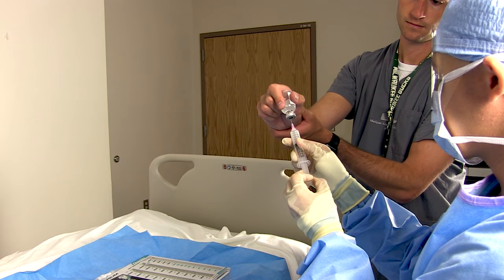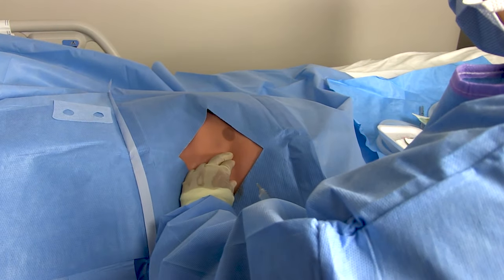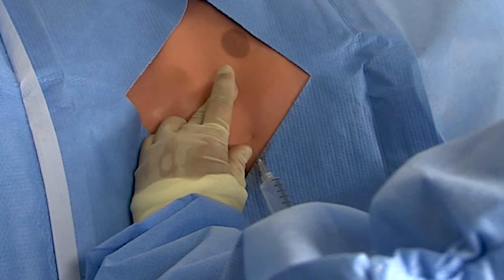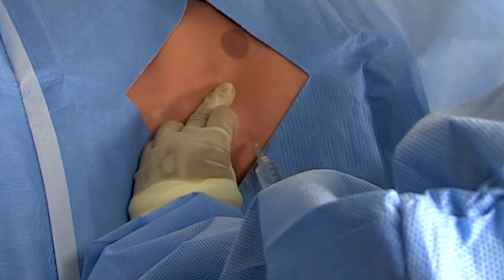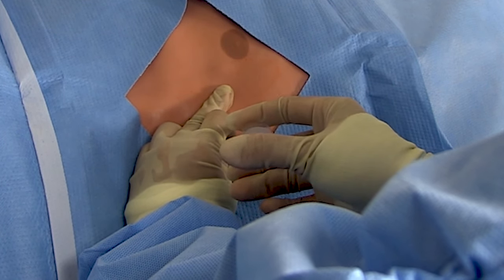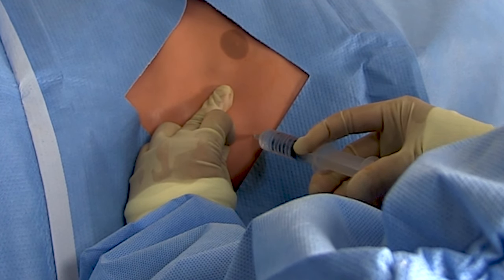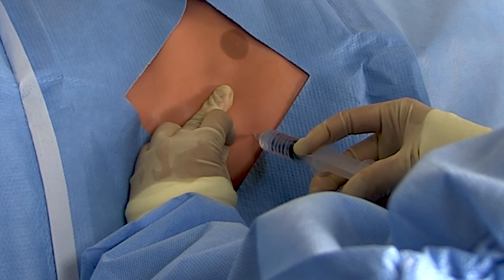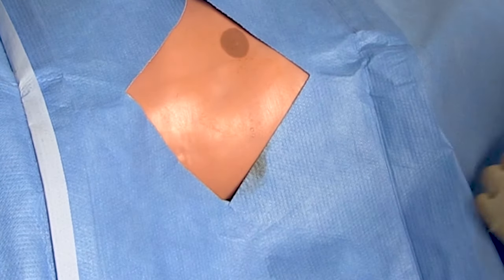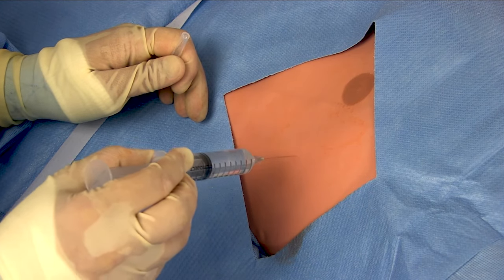Alright, with prep out of the way, drop some local and get to injecting. These are very painful procedures so you want adequate anesthesia. My technique is to first make a little skin wheal with the local, then drive the needle down until I hit the rib. Once I've hit the rib, I inject the periosteum right there, then maneuver the needle over the rib and go a little deeper until I've hit the pleura and inject liberally there. Finally, I slowly withdraw the needle and inject on the way out to anesthetize the entire tract. Wait about five minutes and then do a little skin test with a sharp instrument to make sure the patient can't feel it.